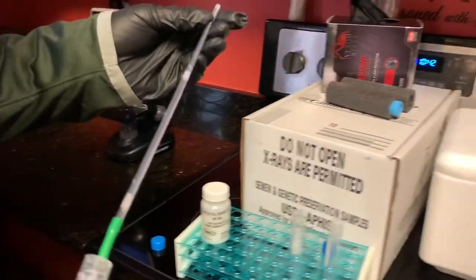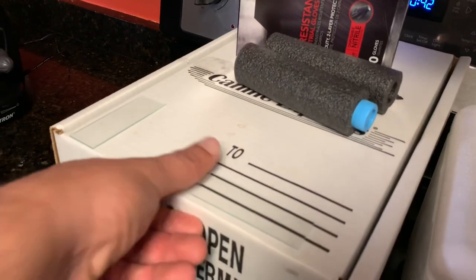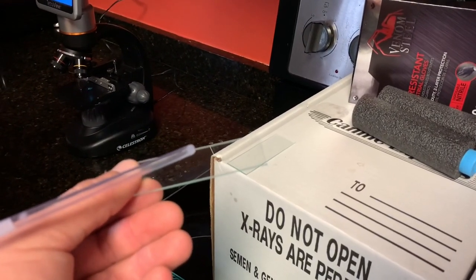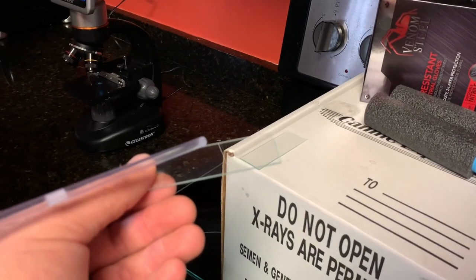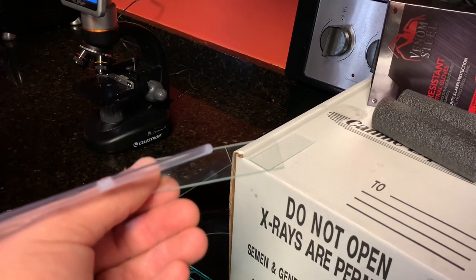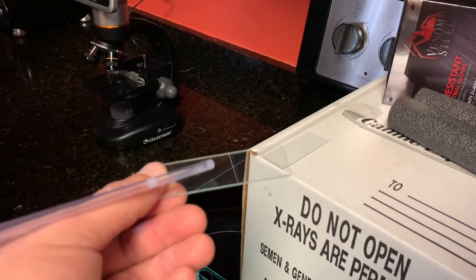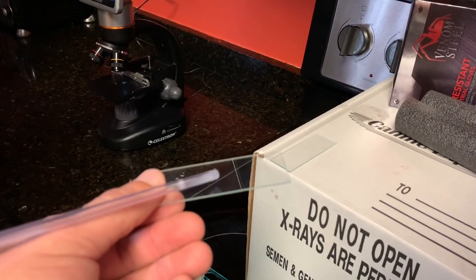Take the straw back off. Actually, you know what we'll do? We'll use the little tip right here for this slide. Make it easier on everybody. So just put a little tiny drop on there for me, Jay. Keep going. I will have to fast forward this part probably because Justin's taking 10 days. But it's okay. There it is.